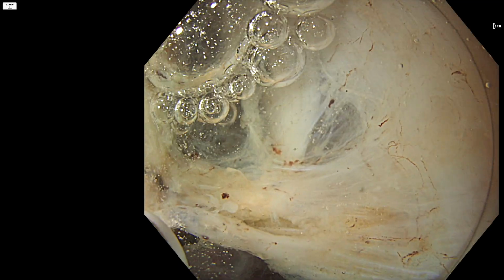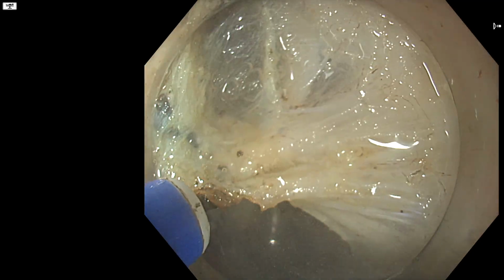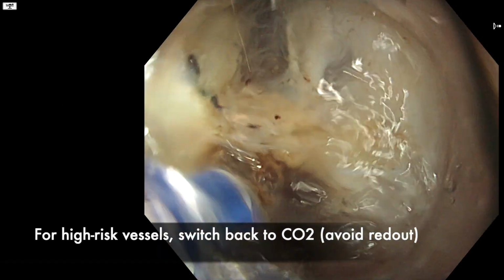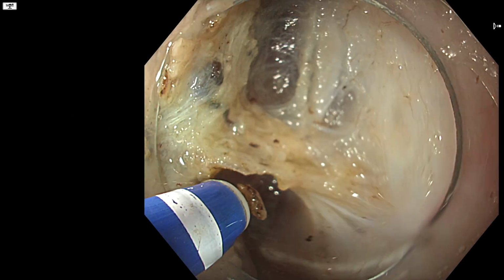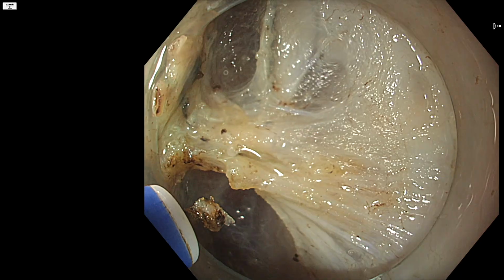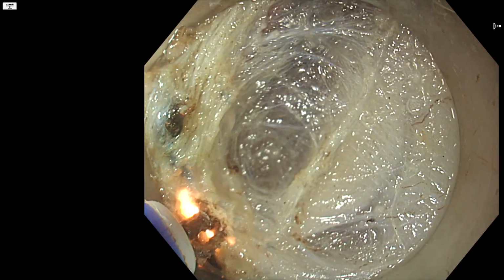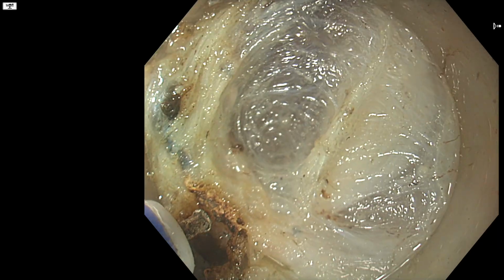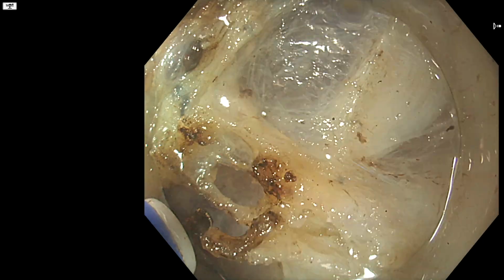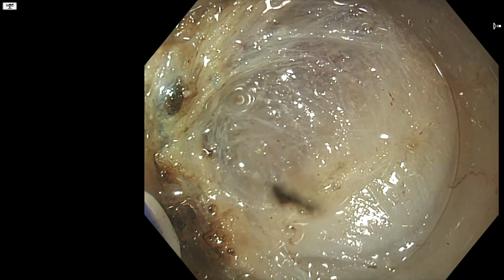We're now ready to cut through the vessels, through all the vessel groups, and I think it's generally a good idea, as I've done here, to suction some of the fluid and go back to the CO2 medium, because if you're cutting through a high-risk vessel or vessel group and it starts bleeding and you're under immersion, you're almost certainly going to get an immediate red out. That can complicate things quite a bit. So generally, unless it's a very small vessel, which I'm confident won't bleed, I'll generally try and remove the fluid so that if it does bleed, it's in a non-dependent position.